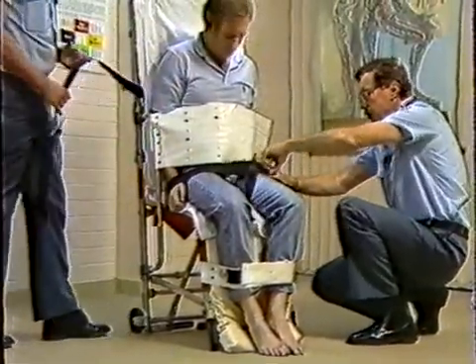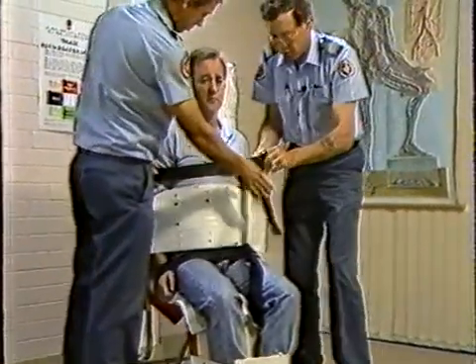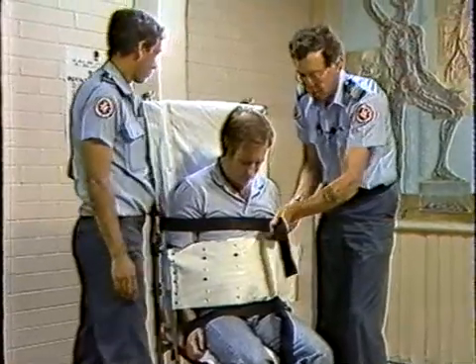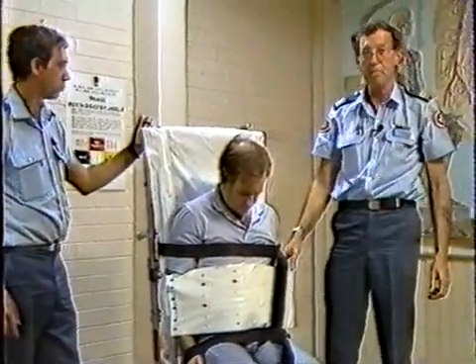Whilst you're doing this manoeuvre, we now put on the safety belts as normal. We must make sure that the patient is reassured and does have confidence in what you're doing, because you're taking away their own instinctive ability to help themselves while we're taking them down the stairs, etc. So we'll have to make sure they're reassured while we're locking their arms up.